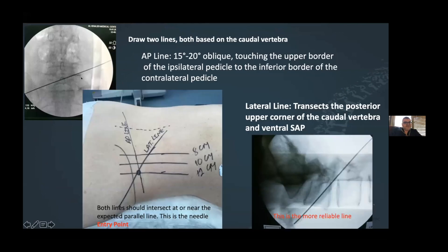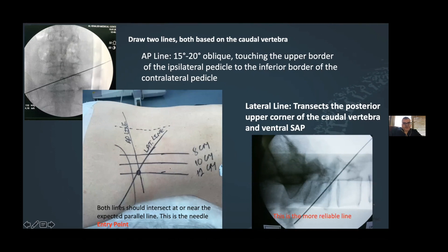Then you draw two lines. The first is the AP line — approximately a 15-20 degree line touching tangentially the upper border of the ipsilateral pedicle and the inferior border of the contralateral pedicle. The second and more important is the lateral line — a 45-degree line touching the posterior upper border of the caudal vertebra. For an L4-L5 discectomy, I transect the upper border of L5. These two lines will intersect at approximately your 12-centimeter line for L4-L5, at 10 centimeters for L3-L4, and correspondingly for upper lumbar levels. I do the same for every single case.